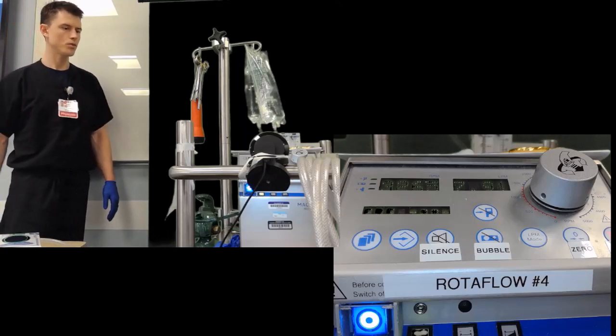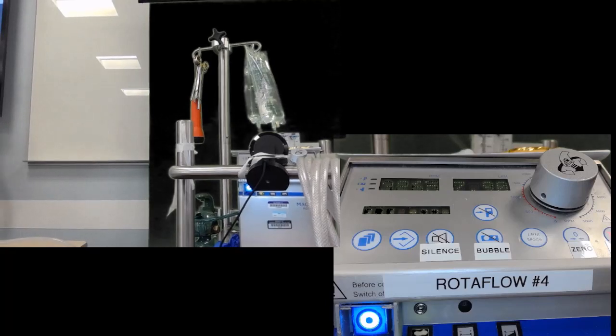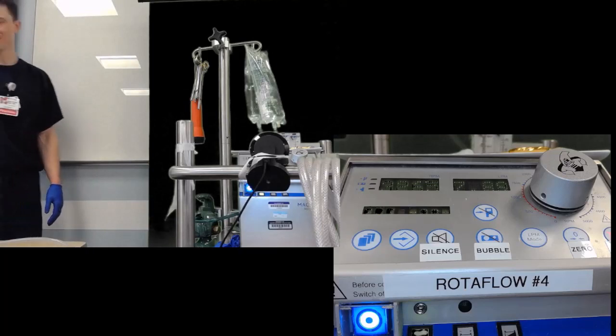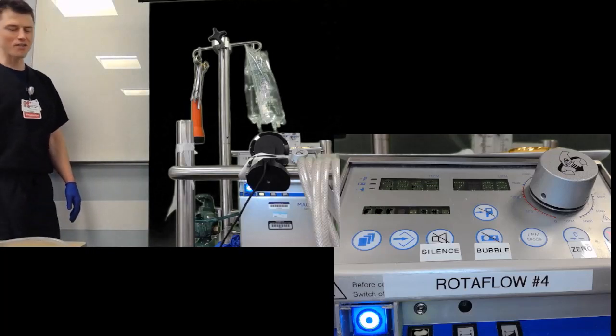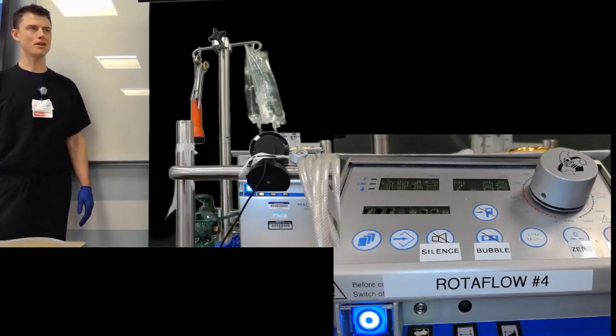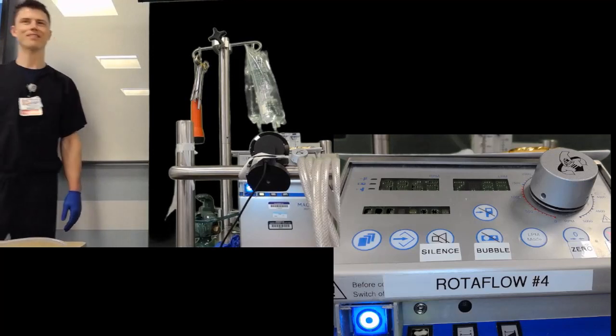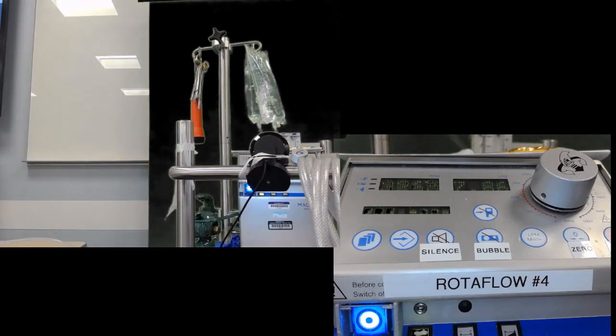All right. So let's say we notice that our patient is pale. Let's say you start seeing air in the circuit. Someone wants to help? Yes, we clamp. Someone come clamp. Come on, Emmy, you wanted to try it? Okay, so how you can emergently clamp. Yep, okay, you can grab your clamps.